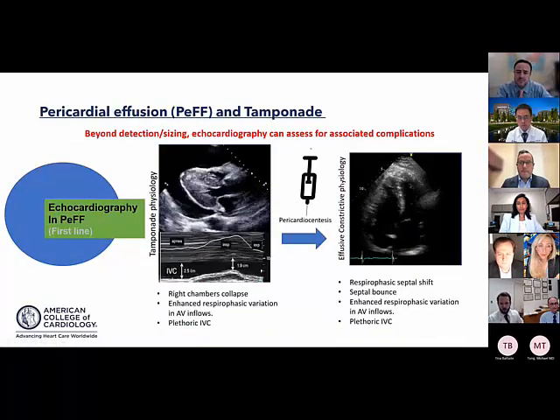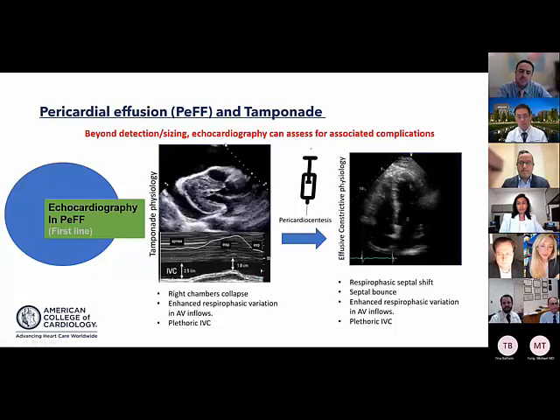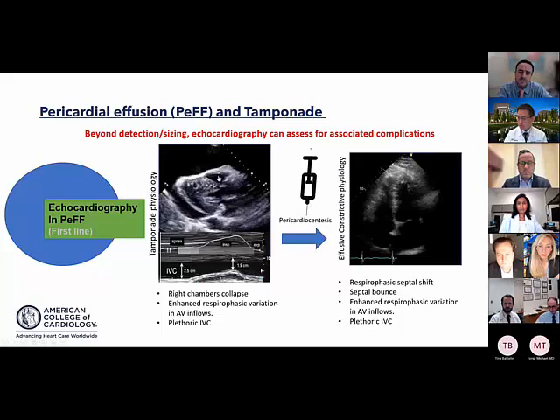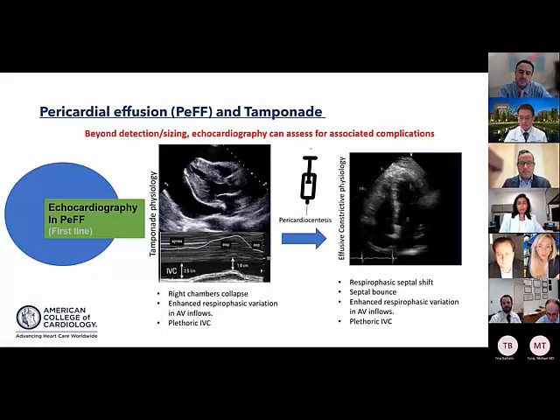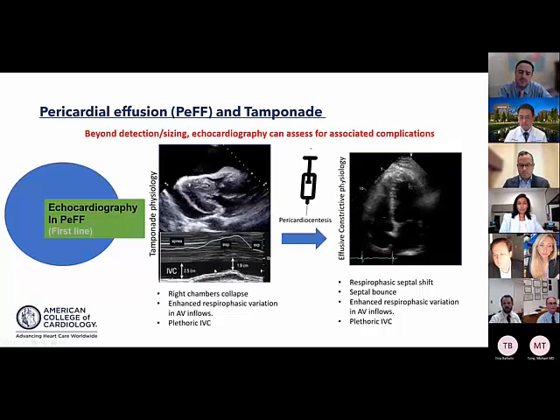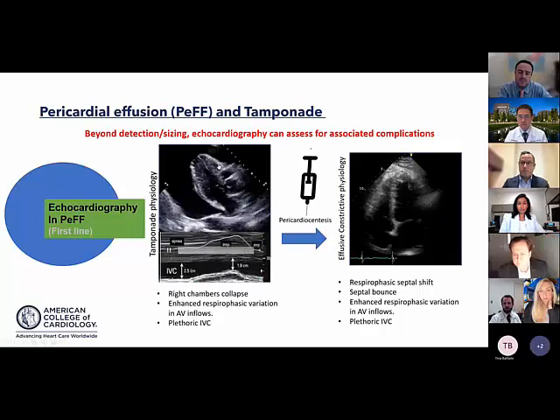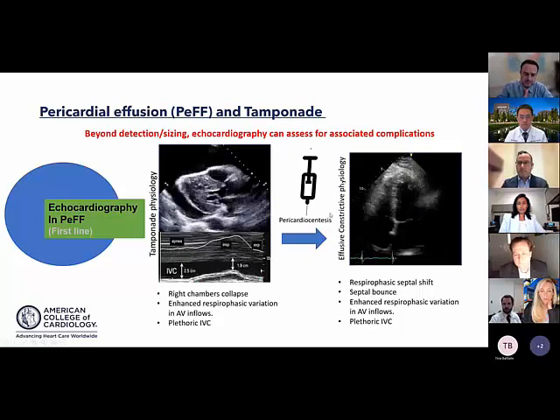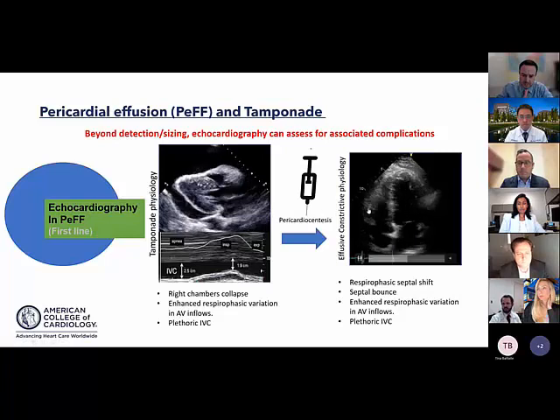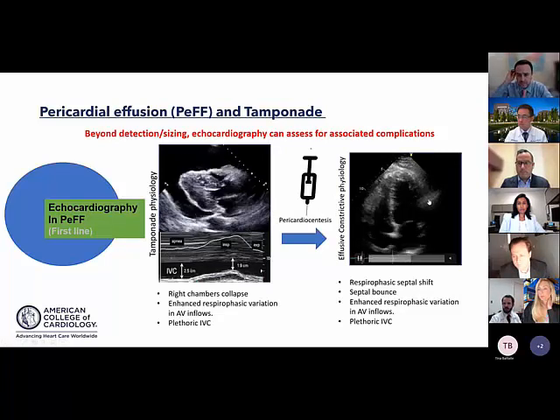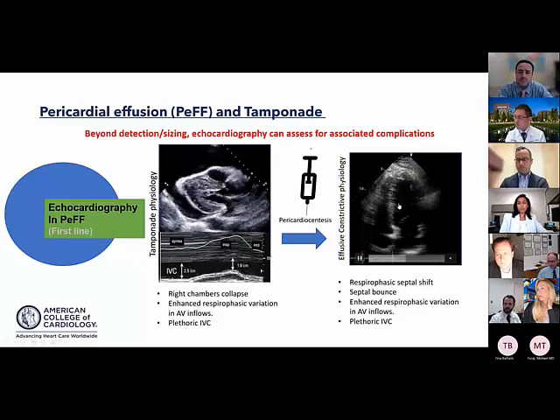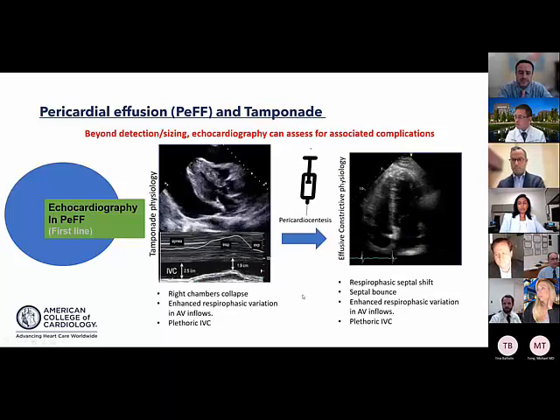Beyond characterization, it is important to evaluate for complications. Tamponade features include a large effusion with right ventricular collapse and a plethoric IVC that does not collapse with respiration or Valsalva. But it is equally important, after pericardiocentesis, to look for recurrence and assess for effusive-constrictive physiology — evidenced by septal bounce and respirophasic shift — which may be treatable.